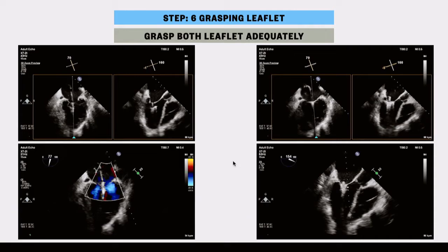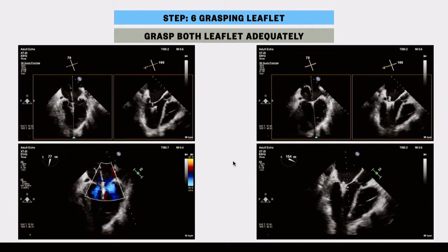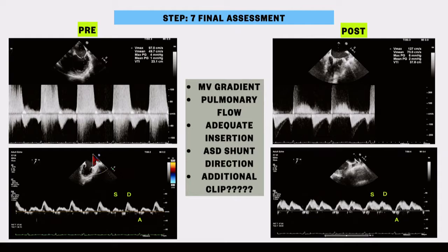Final assessment: check mitral valve gradient, pulmonary vein flow, adequate leaflet insertion — ensure no single leaflet detachment — assess the ASD shunt, and determine if an additional clip is required. The pulmonary vein flow is very important: if there is no systolic flow and only diastolic flow, that indicates significant residual MR. Normally, the majority of pulmonary vein flow occurs during systole — LV systole when the atrium is in diastole.